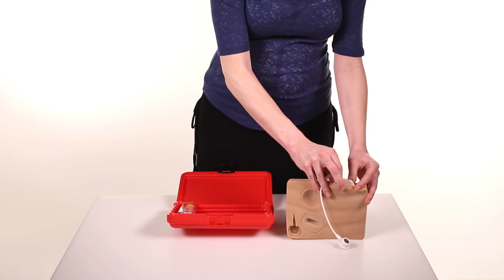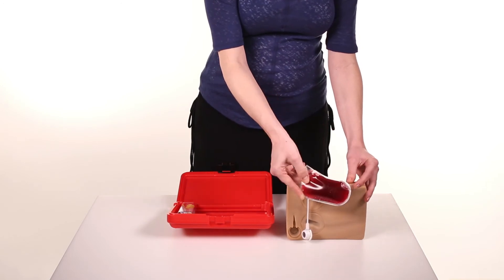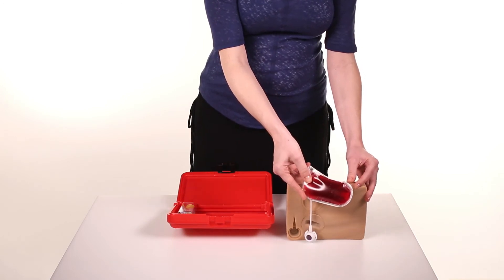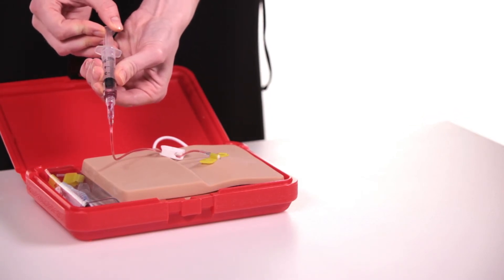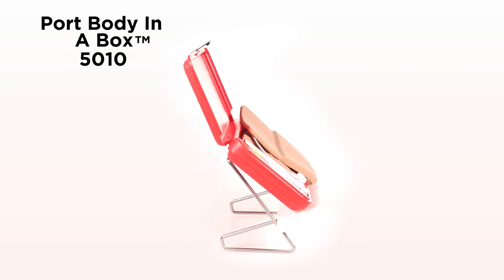The artificial blood bag is contained within the tissue block and normally does not need attention. Refilling the bag is done with a Huber needle through the septum in the port.